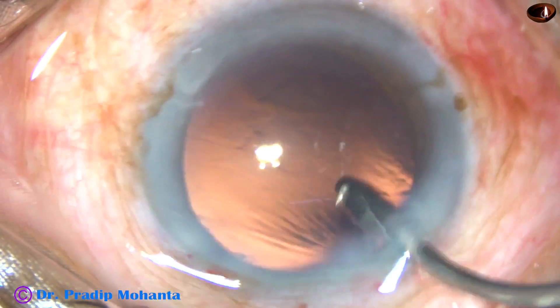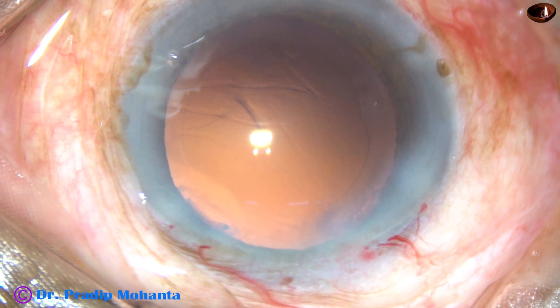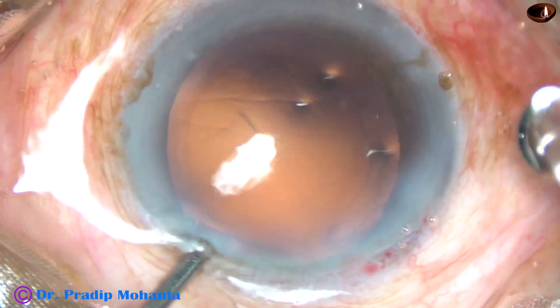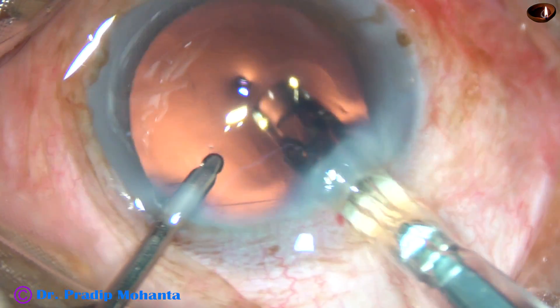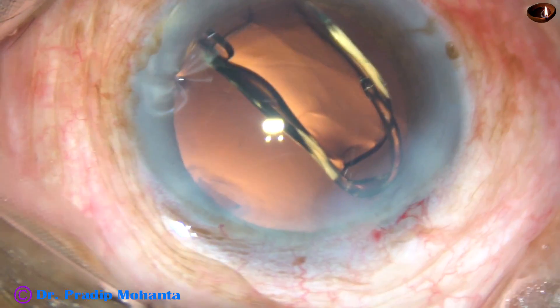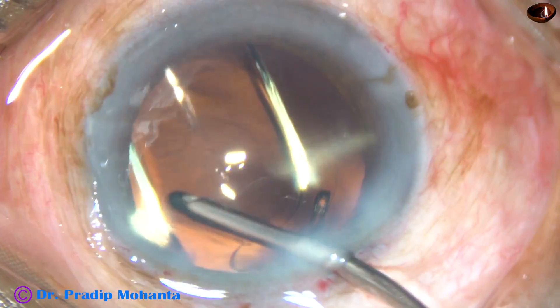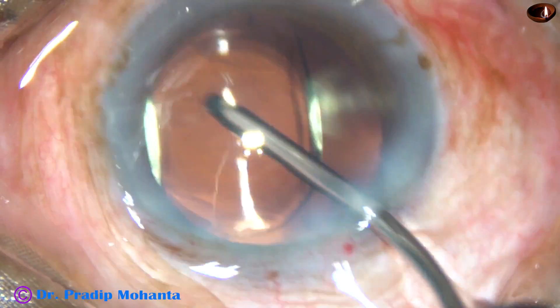By this time the intraocular lens is being loaded in the cartridge by my assistant. And here is the intraocular lens. This is a hydrophobic single-piece intraocular lens. It is Super Fove from Appa Swami Associates. It has got a yellow tinge.